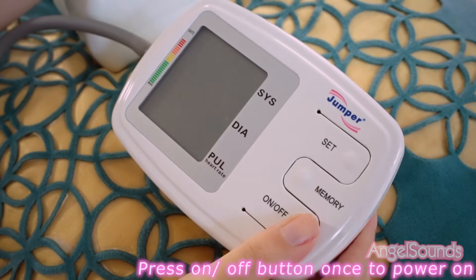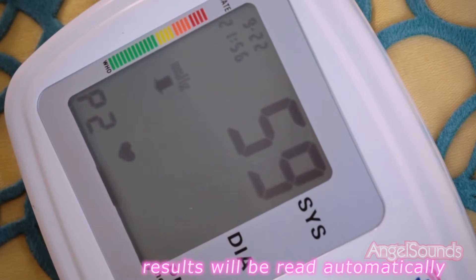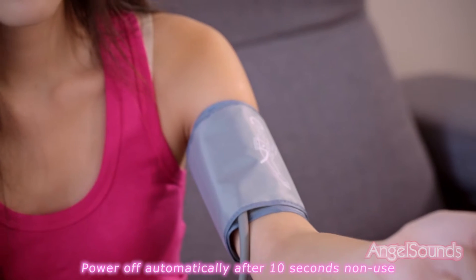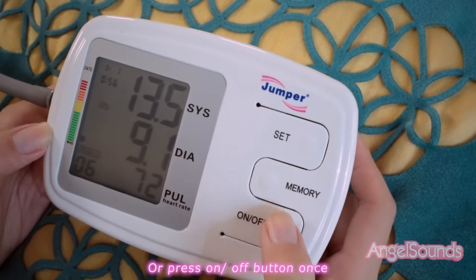Press the on-off button once to power on. Results will be read automatically. The device will power off automatically after 10 seconds of non-use, or press the on-off button once to power off.